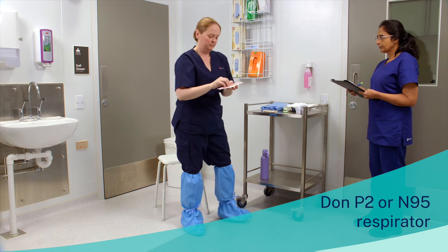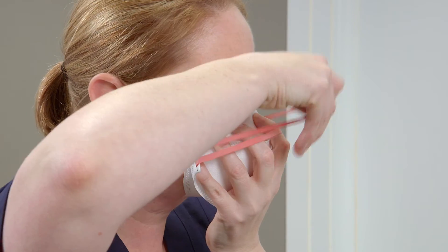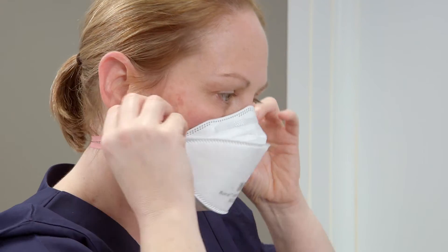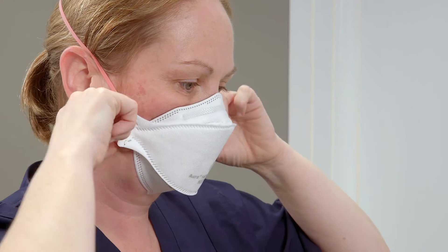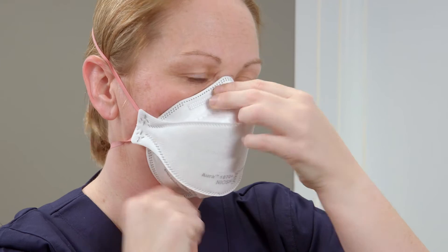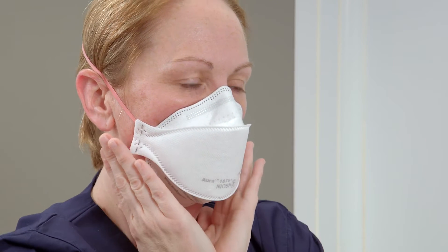Don a P2 or N95 respirator to cover nose and mouth. Perform a fit check immediately after donning the respirator. Breathe in and out to check that air is not escaping and the respirator fits you well.